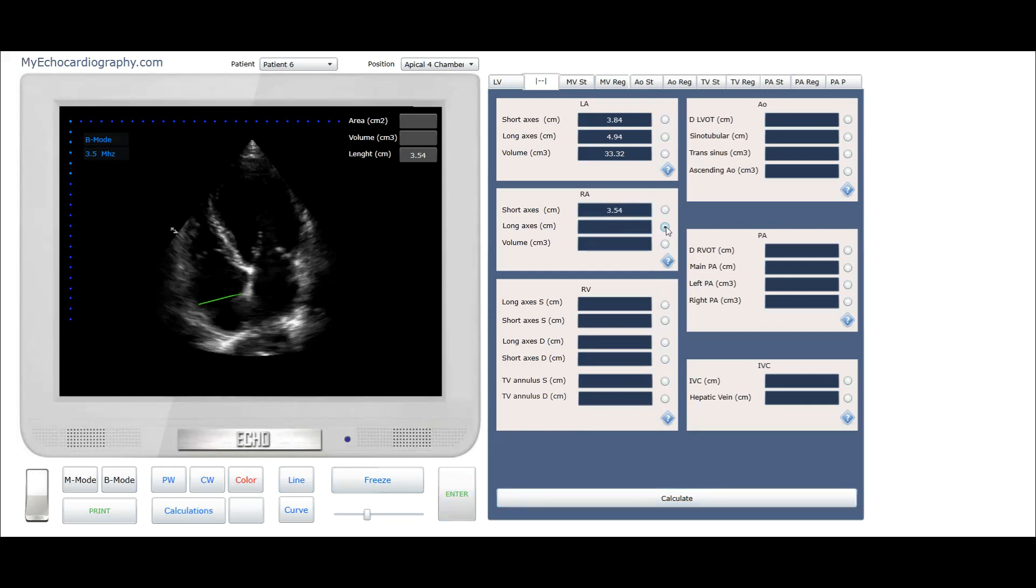Select right atrium long axis. Start measurement of the long axis from the central point of the tricuspid annulus. Short and long axis must be perpendicular to each other.